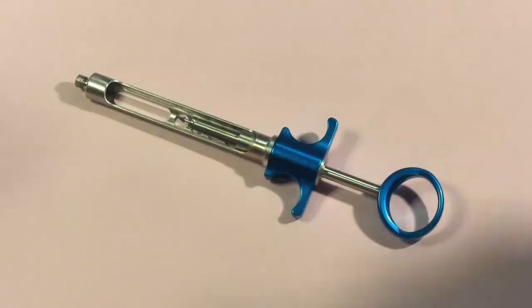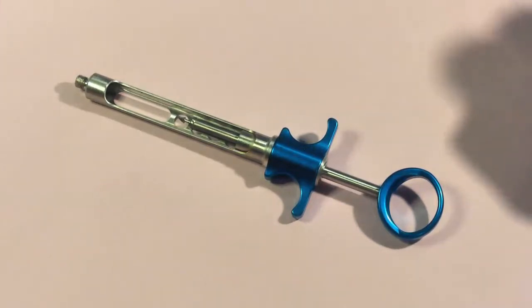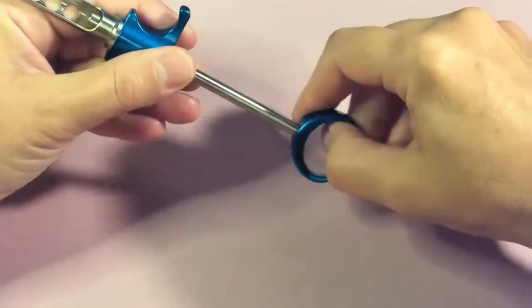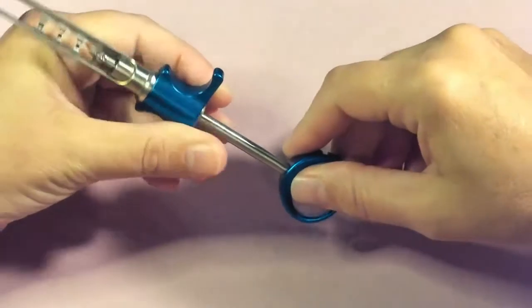In this video I will be reviewing assembly and disassembly of the syringe along with aspiration and sharps disposal. The first thing we want to do when assembling our syringe is retract the thumb ring and pull back on the piston to the fullest extent.